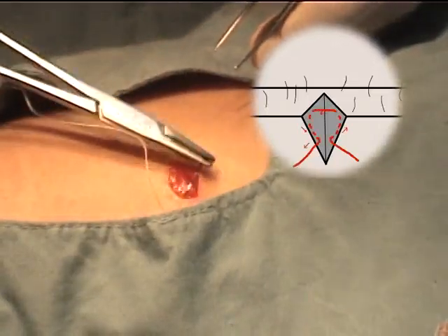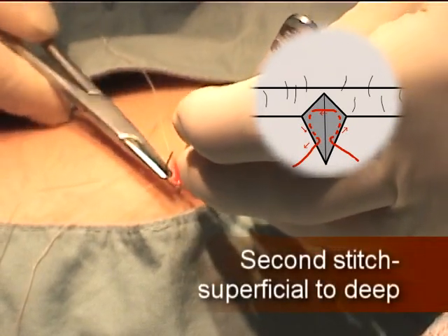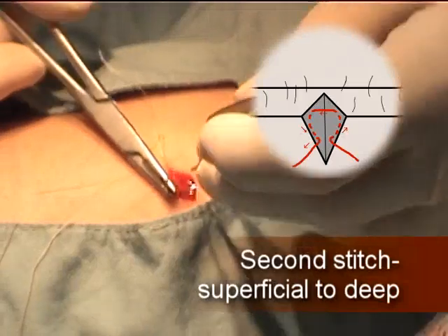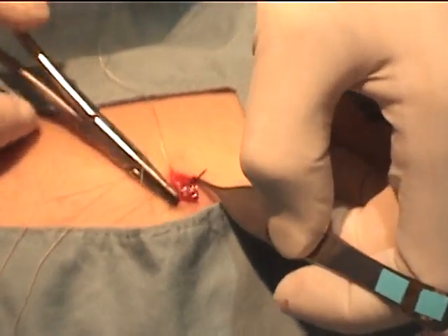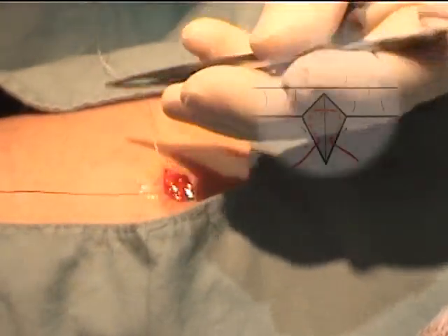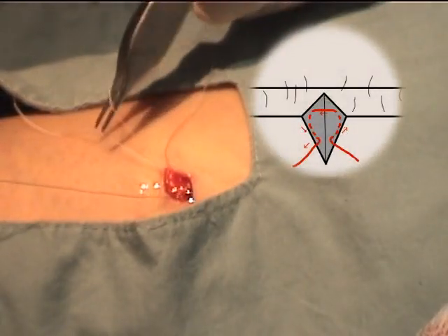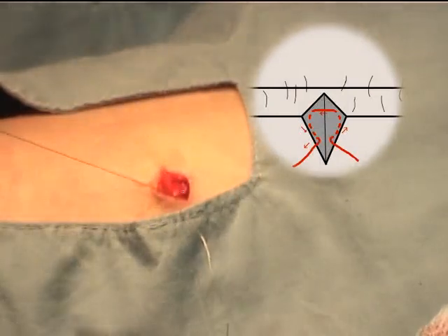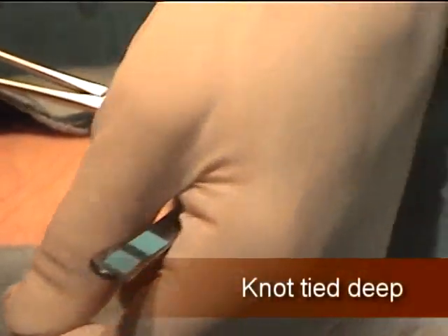The needle tip enters the deeper layer of the subcutaneous tissue, then is brought upward so that it exits the same side more superficially, often in the subcuticular layer. Bring the needle to the other side of the wound and it enters in the superficial aspect of the wound at the same level as the first side. Drive the needle deep so that it exits the tissue deep in the wound space where the stitch started.